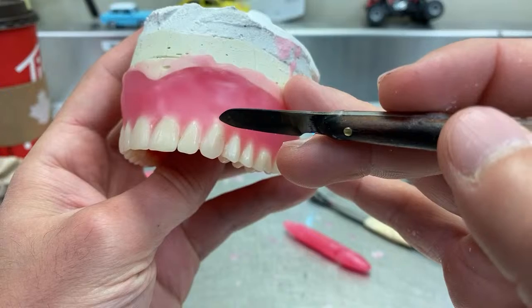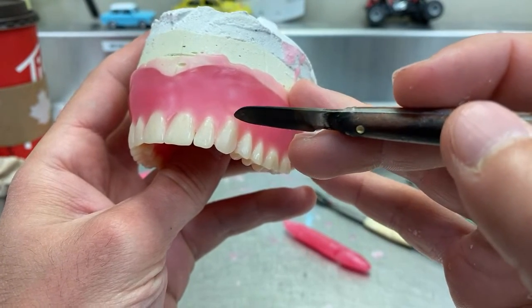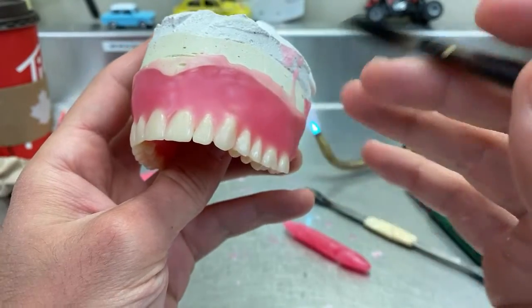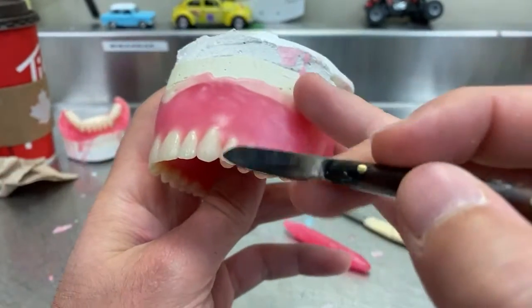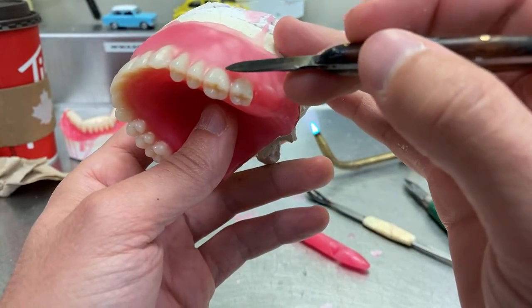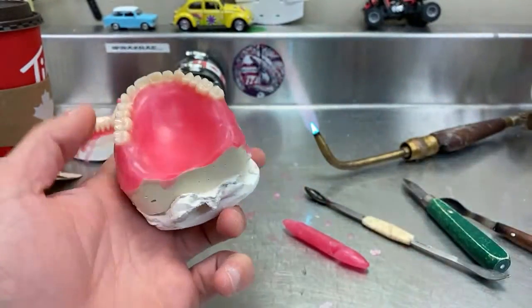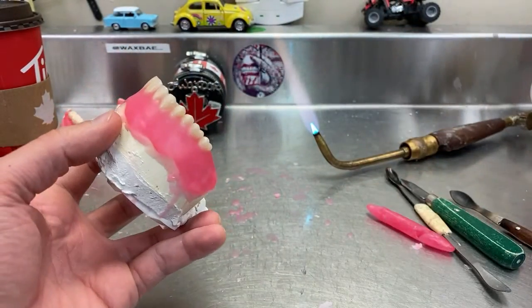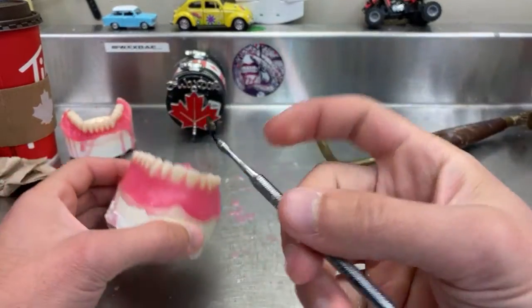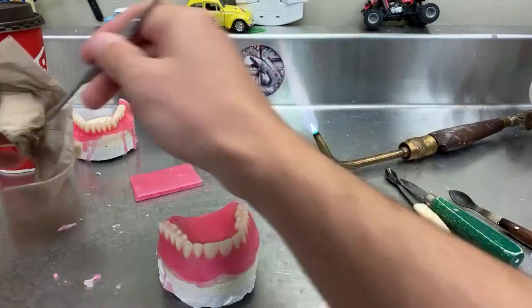That's the end of the tooth right here, so I cannot carve that one, because when I carve it I will hit the end of the tooth and it will be like a hole here. Never do that. A little bit more here, a little bit here, a little bit here. So by doing that, what I like to do is bring something like this, because it's a small job, so you want something to be precise.